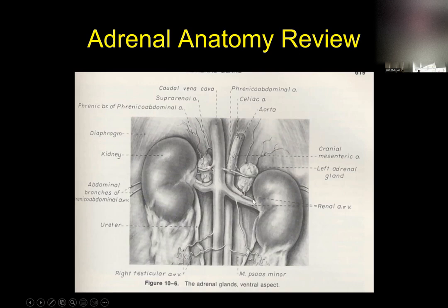And then you find the renal artery, and somewhere between the branch of the renal artery coming off the aorta and the cranial mesenteric branch, in that area is where the adrenal gland should live. And to me, that is, again, needlessly complicated. It's kind of cool to know all that anatomy, but truthfully, I don't remember the names of these things either. But I do remember this vessel.